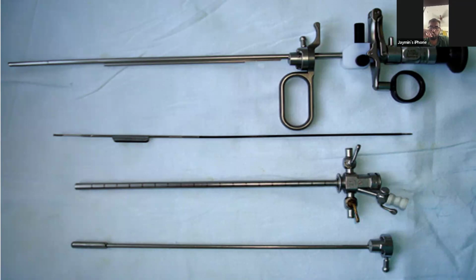For the procedure, once the sheath and working element have been assembled, first we do a diagnostic cystoscopy after observing the stricture.